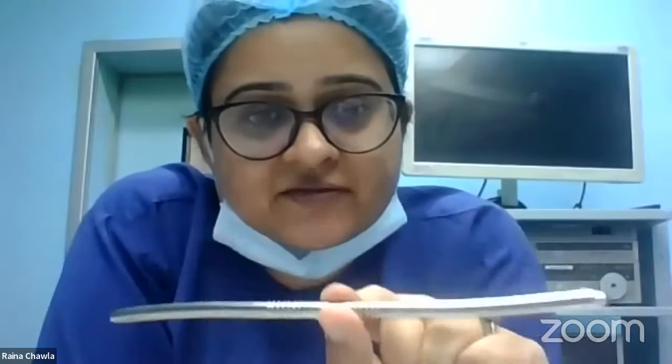So how do we know how much to dilate to? Anyone? One number less than the weeks of gestation. There's a little controversy in this. Some books say we dilate till the number equal to the period of gestation. Some books say one less. So if she's 8 weeks, we dilate till Hegar's number 7. But some people say if she's 8 weeks, dilate till Hegar's number 8. It depends on where you're reading from. But as you're saying, you're right. If she's 8 weeks, dilate till Hegar's number 7.